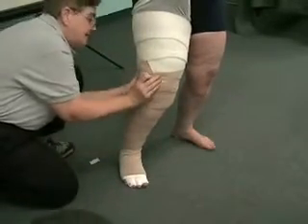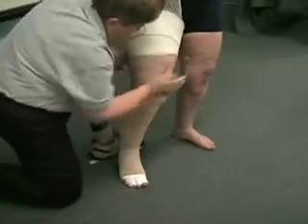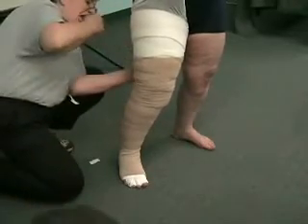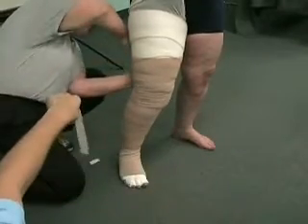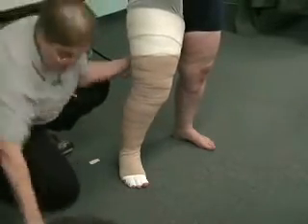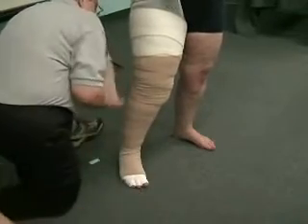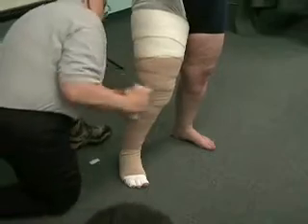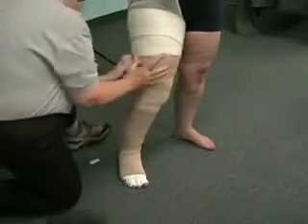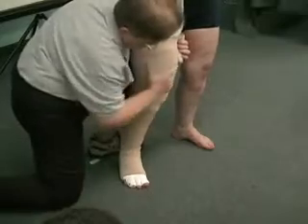Is that a second 10 that you're using? Yeah. But if I had a 10 by 10, that'd be going up, but since you don't have it. Gotta give them a little longer. There's a lot of tension on this bandage, so you have to use a long piece of tape. Otherwise, your bandage will pop right off. Hear it? Feels good. I'm going to take this one up like this. Go right on over the knee. Mold.